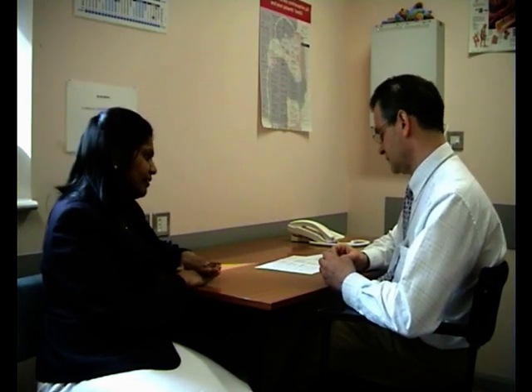We put the tube into the bladder to measure the residual urine that's in there. And this tube also measures the pressure in your bladder. We also put another tube in your vagina to measure the pressure. And then we connect all these tubes to a machine, and we'll fill you up with water. We will then ask you to tell us when you can feel the first urge to wee, so that we can note it down.